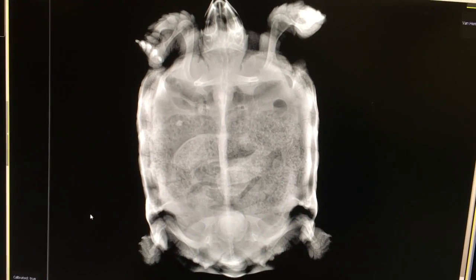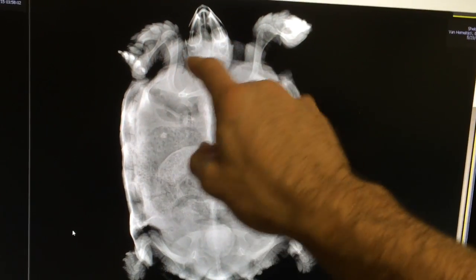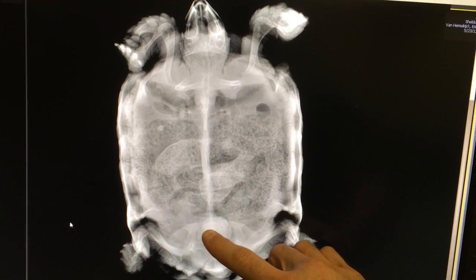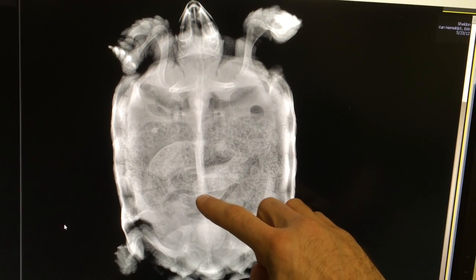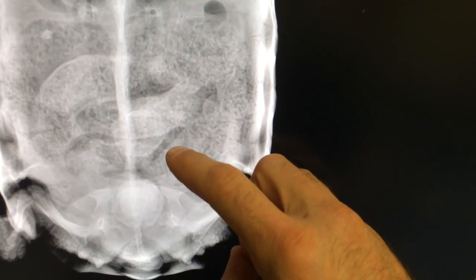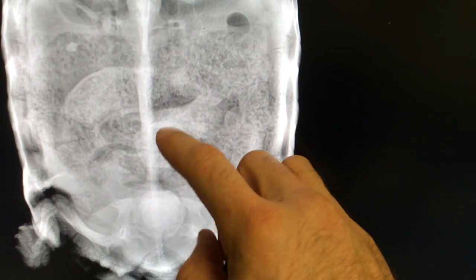I wanted to show you guys the x-ray — this is how we actually diagnose the stones. Here's our tortoise head, front legs, back legs. And if you see this circle right here, that does not belong — that's one of the stones. And here is actually another big stone if you can make out another circle there. It's kind of tough to see on x-ray, but with this contrast it brings them out a little bit more.